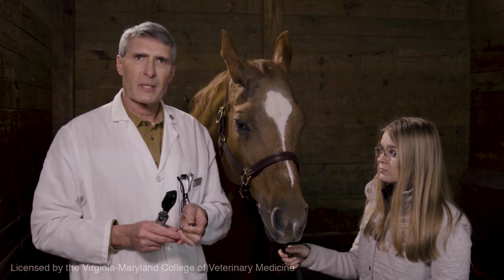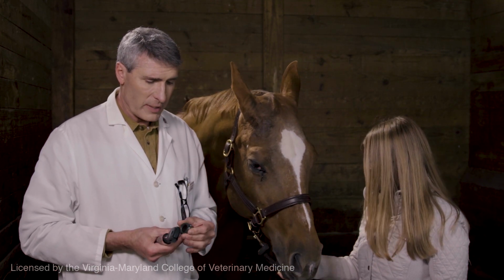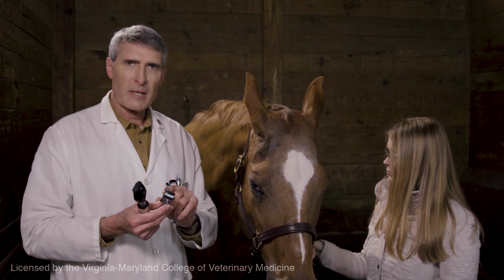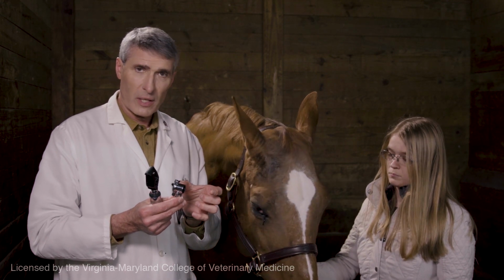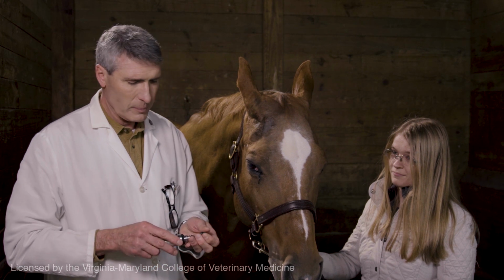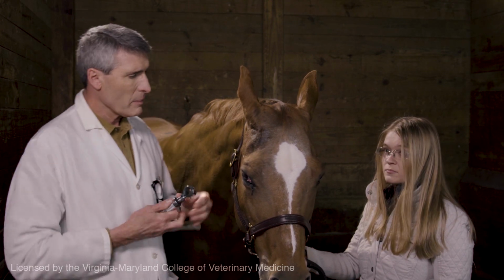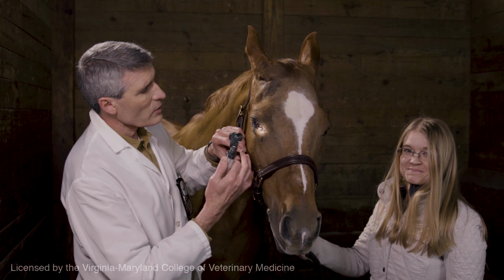Another piece of equipment that many people have available, and that a lot of people like to use, especially large animal practitioners, is the otoscope. Now the otoscope, a veterinary otoscope, has a 10 diopter lens and it's going to focus at 4 inches. That's the length of the otoscope cones. And so with the otoscope, I can put this on, and looking through the lens, I'm going to be able to focus at things at 4 inches, just like I did with the direct ophthalmoscope.